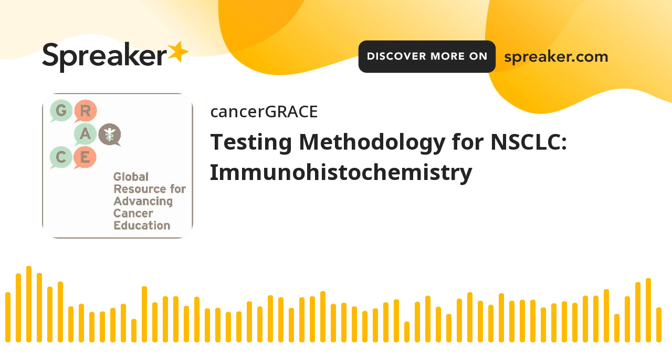Some important things to think about when we talk about PD-L1. First thing is PD-L1 is reported as a range. So when you get a report, the tumor proportion score will typically say something like 0%, 1%, 20%, 45%, 60%. It's a continuous variable from 0 to 100. But when you interpret clinical trials, you'll oftentimes see that PD-L1 is broken into what's called a categorical variable. So they'll say something like PD-L1 high or low. And this matters when we think about how patients are being grouped.